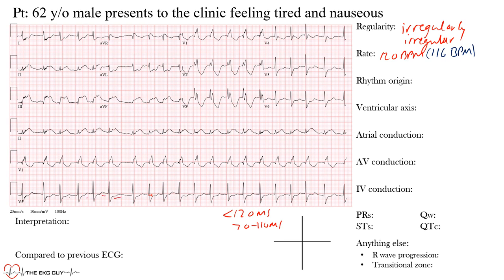Those deflections at the end are T waves, not P waves — you can confirm this by looking at leads above and below. So we have no P waves. We have an irregularly irregular rhythm at 116 beats per minute, no P waves, but consistent conduction throughout. The rhythm is coming either from the atria, AV junction, or ventricles given the wide QRS. Because it's irregularly irregular, the rhythm is likely coming from somewhere in the atria.